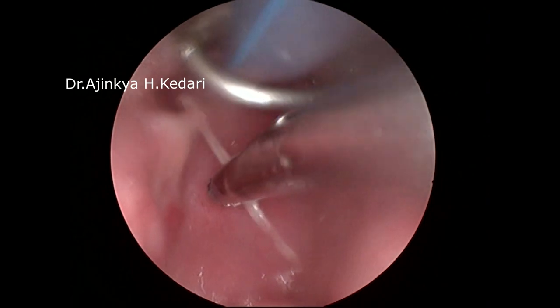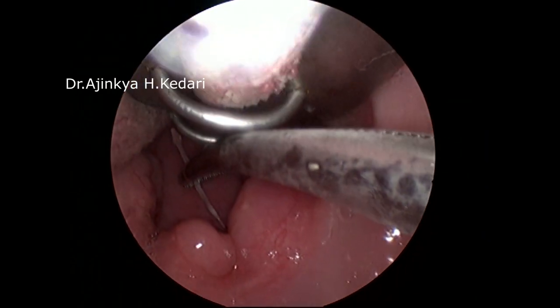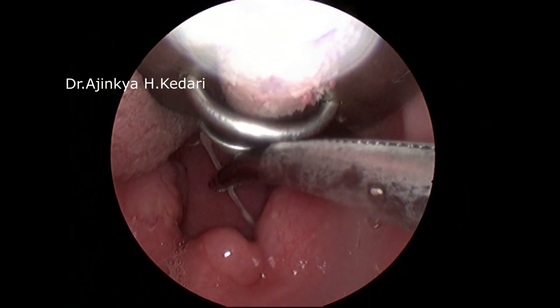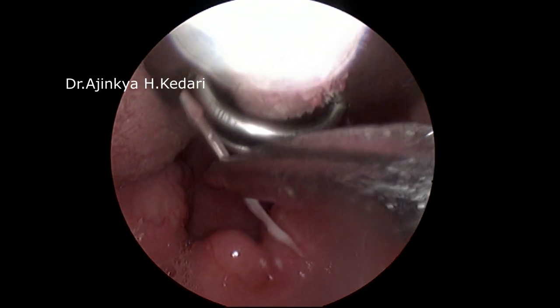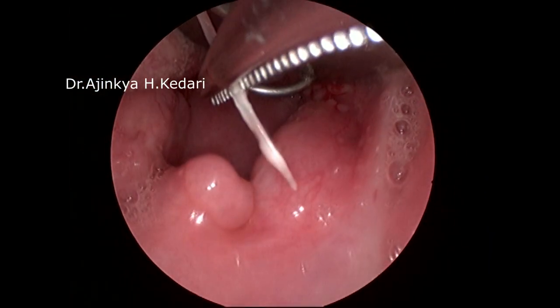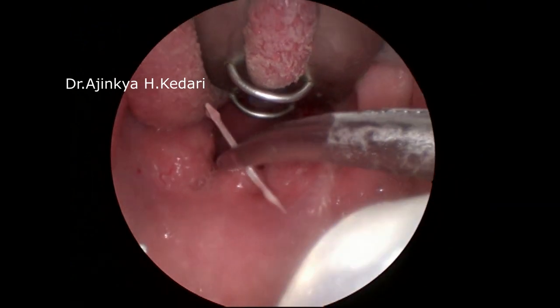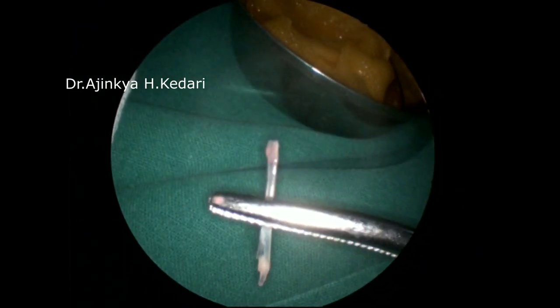I'm then going to twist it — that is, rotate it clockwise — and then try to come out under vision. Never ever come out without vision; it should always be under your vision. I'm going to come out very carefully so as to prevent re-entry somewhere else. If you do not remove the fish bone sideways first and you rotate it without removing it sideways, it's going to break up and the remaining half will be left in the tonsil, which will lead to secondary infection. That's it.